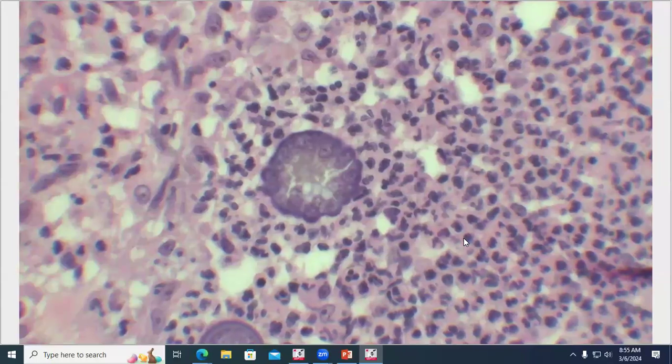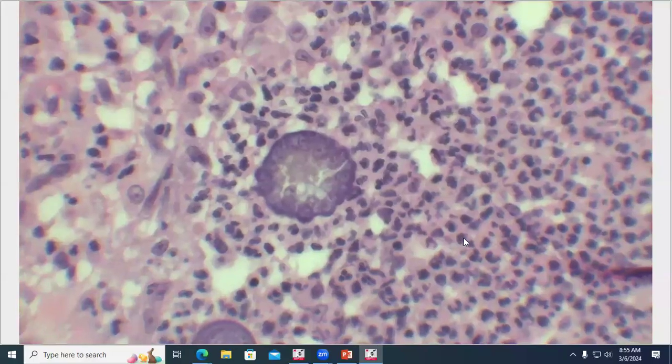Again, probably an ocular manifestation of systemic disease. You'd be worried about systemic mycosis in this kitty. And you can tell in particular because of the endosporulation. So these are fungal spherules, little daughter endospores inside, and then the cell wall ruptures and releases their little babies into the world.